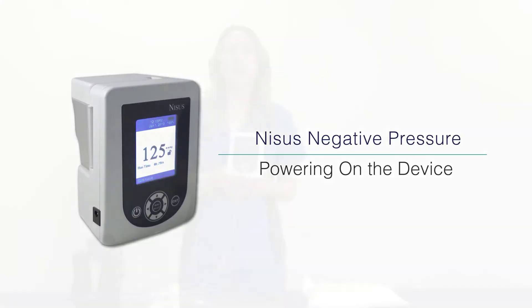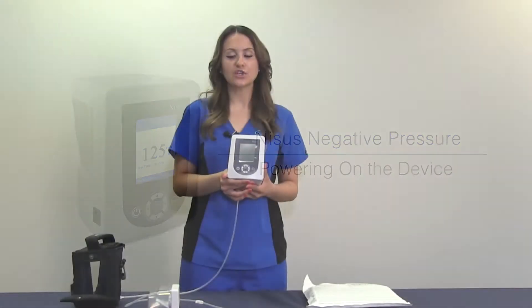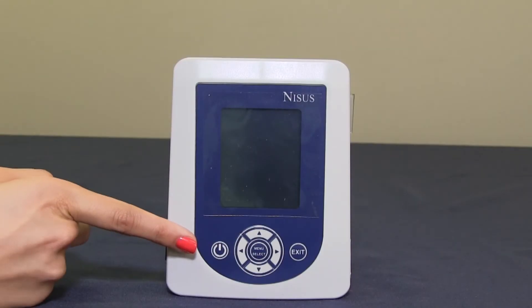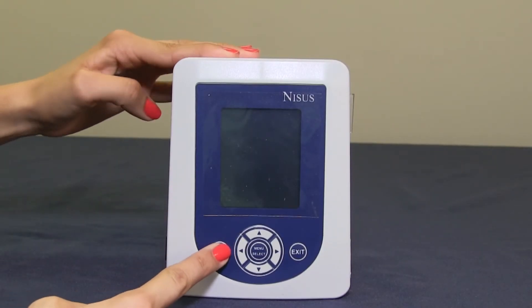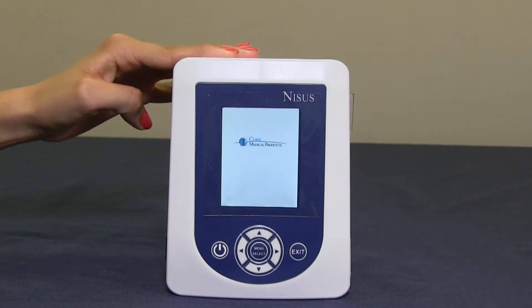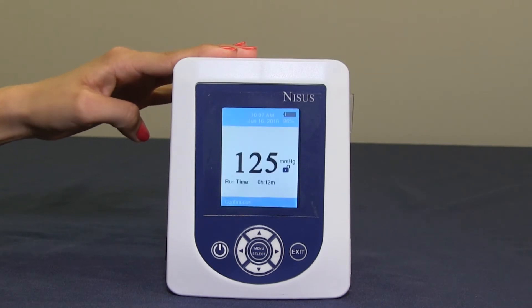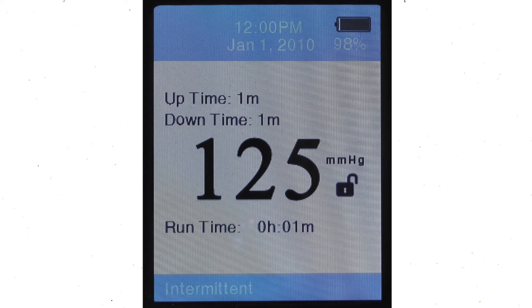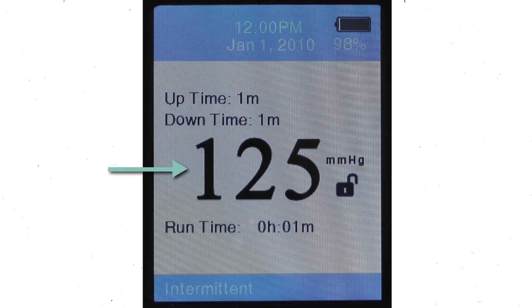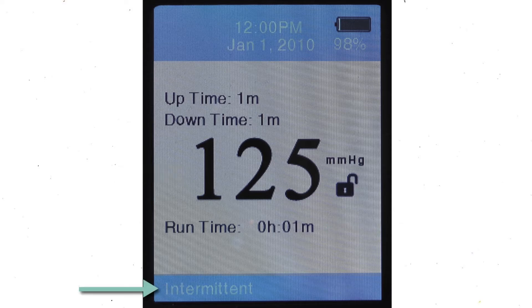In order to power your device on, locate the power button, press and hold the power button, and the device will power on. The base screen will display date, time, battery indicator, your pressure setting, run time, and the mode of your therapy.